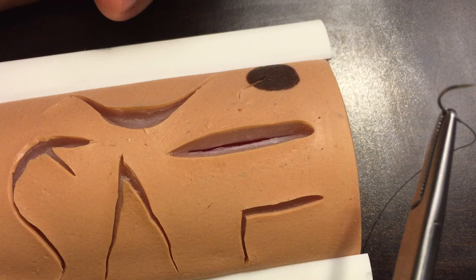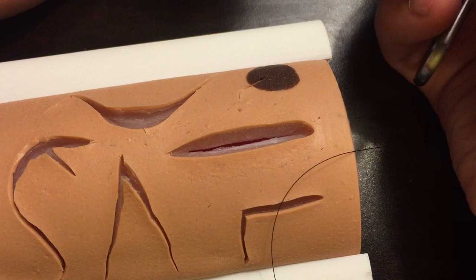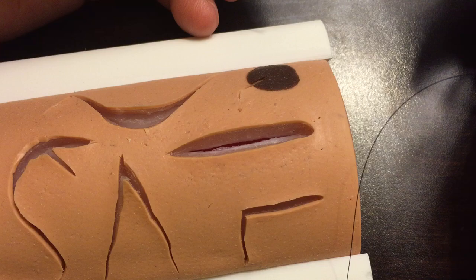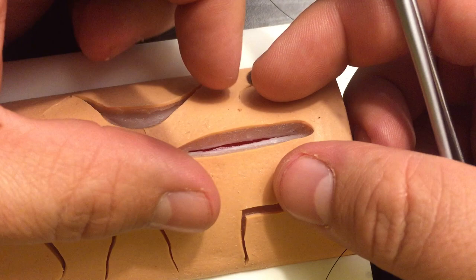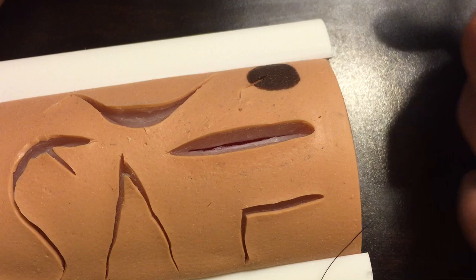The suture you use needs to be absorbable, and most commonly we go with monocryl. Monocryl is a great suture for this technique, which is used when dealing with small, simple, well-approximated lacerations or incisions to avoid scarring — so we want to use a 5-0 or 6-0 monocryl. On this model today I've set it up on the tension base so it's open so you can see better what I'm doing.